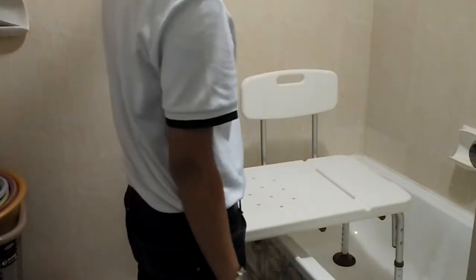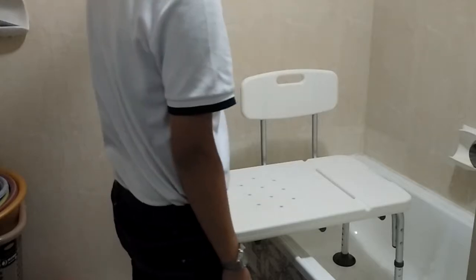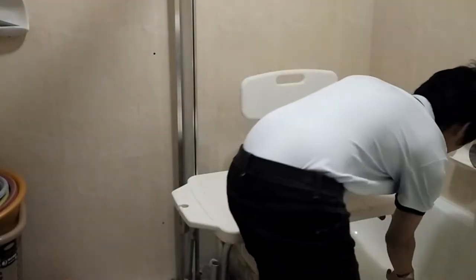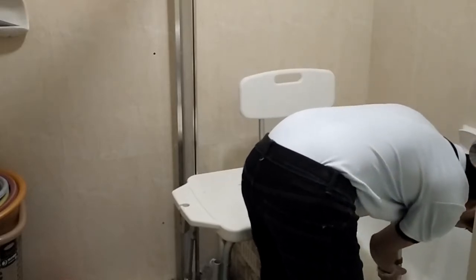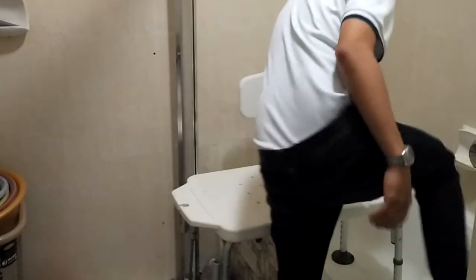Ensure that the transfer bench is facing upwards towards the ceiling. Adjust the legs of the chair so that all four legs are stable and in contact with the ground. Make sure you hear a click to ensure that the legs are locked into place.